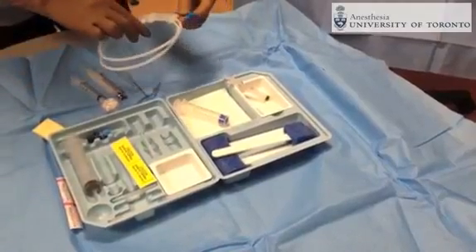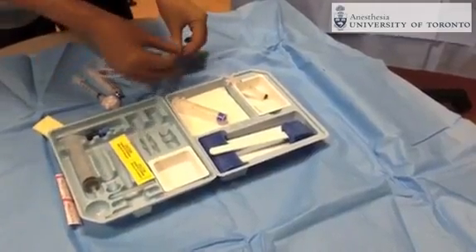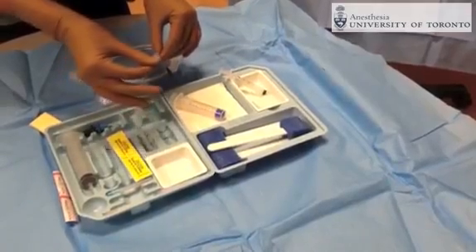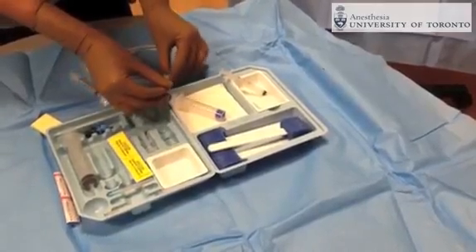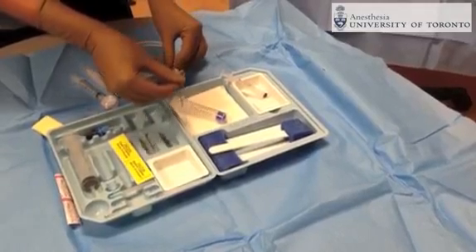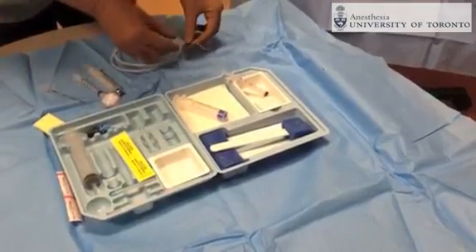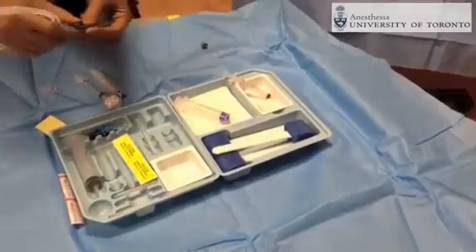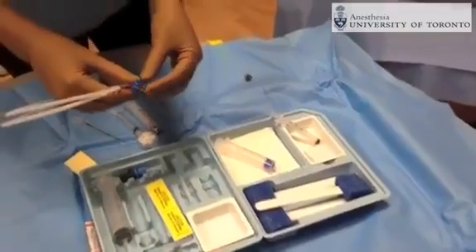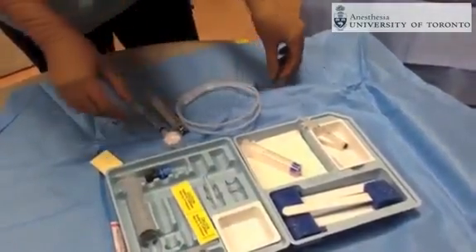This is the epidural catheter that will feed through the epidural needle. The epidural catheter has markings on it to help gauge the distance that you want to thread the catheter into the patient's back.